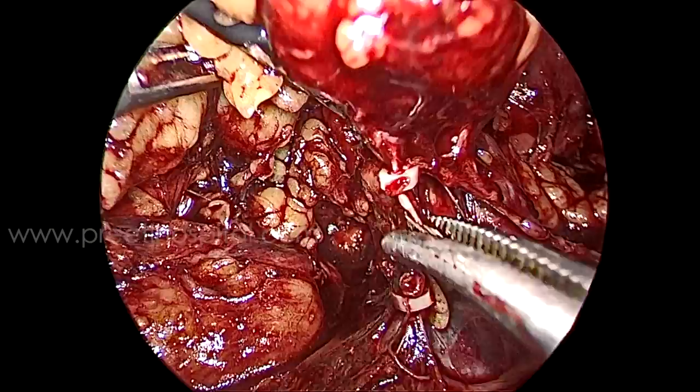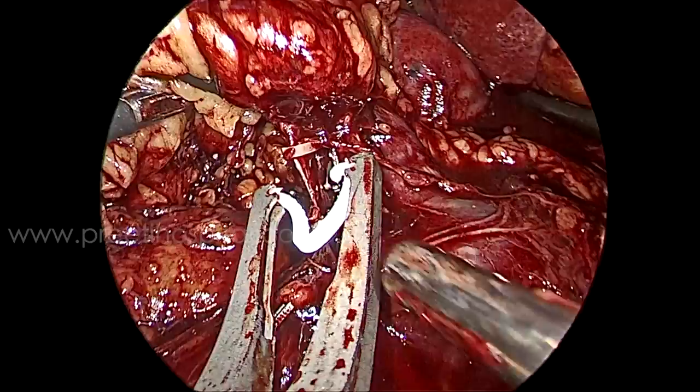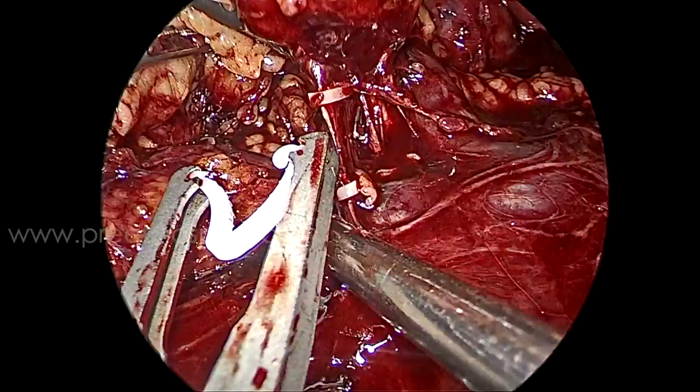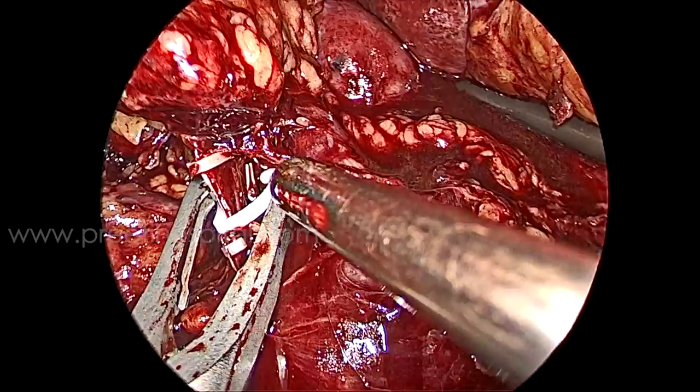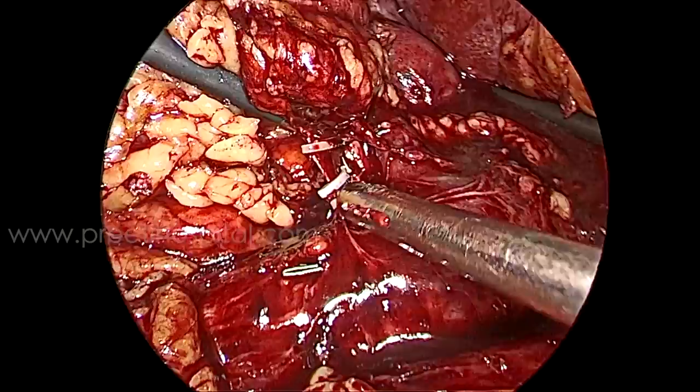They are non-traumatic. You can also take Prolene stitches, but in this case I did not take that chance because of the second vein. I am applying one more clip on two sides because one thing has already happened — don't take chances. My assistant has nicely applied the clip here. My movements are now very slow. The artery is behind, and we have seen it — so be careful that the artery is not clipped when planning for partial nephrectomy. Now everything is under control.